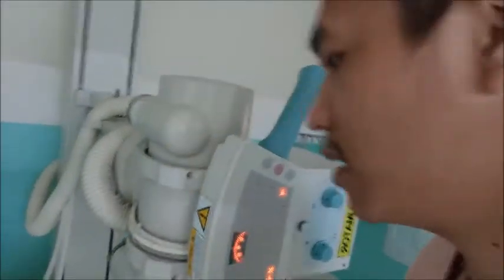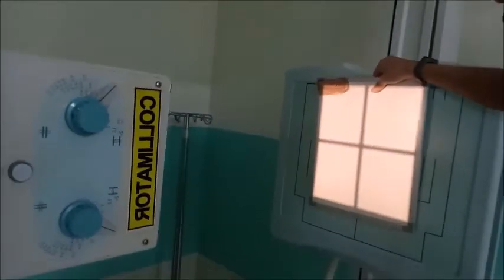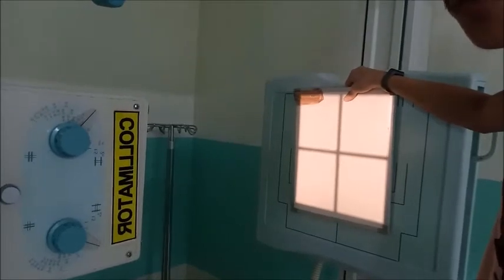For the lateral of the chest, you use an 11 by 14 cassette, with the collimation for the 11 by 14 cassette.